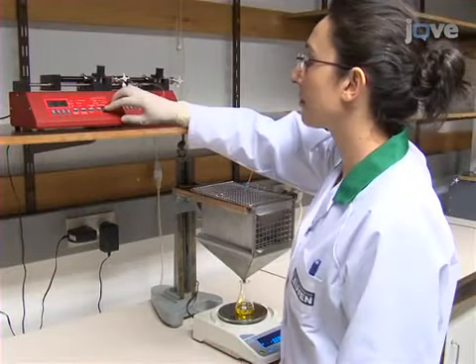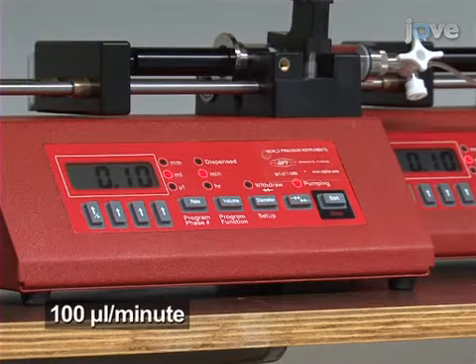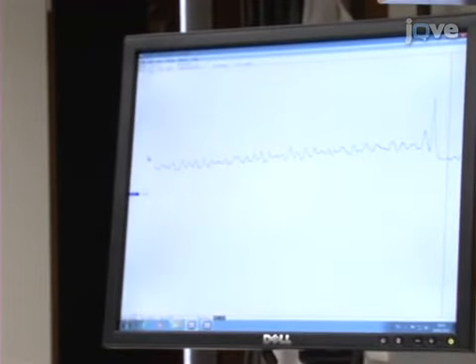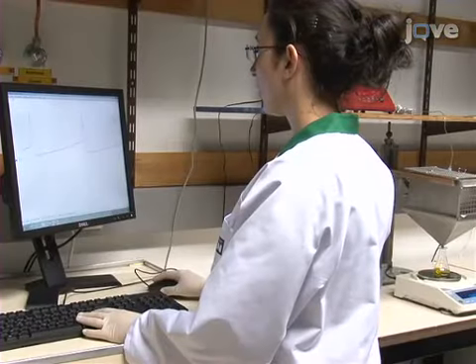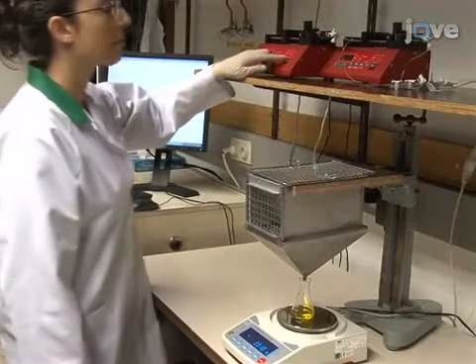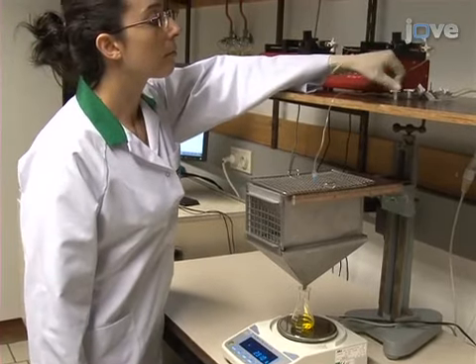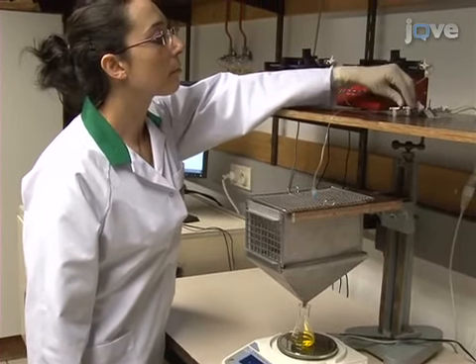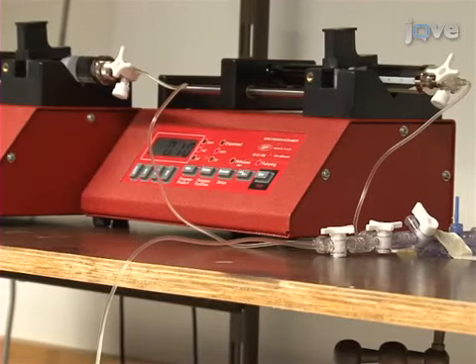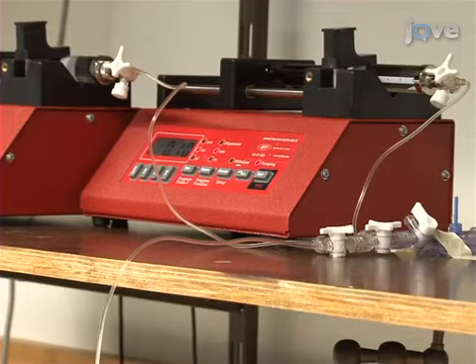Begin the control measurements by starting the infusion pump to instill saline into the bladder over a 30-minute period. The metabolic cage is suspended over a digital balance, which is used to estimate the rat's voided volume. The intravesicular pressure is recorded as the bladder fills and empties. In the next step, drugs can be administered systemically or intravesically over another 30 minutes of data collection. When the experiment is complete, the animal should be sacrificed.